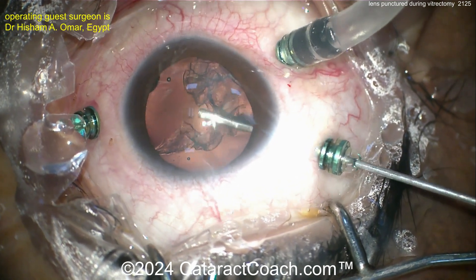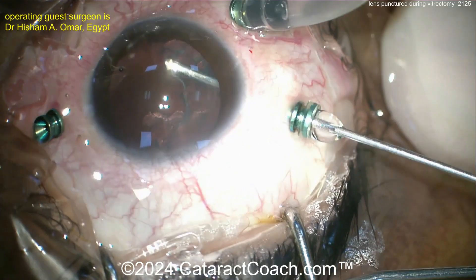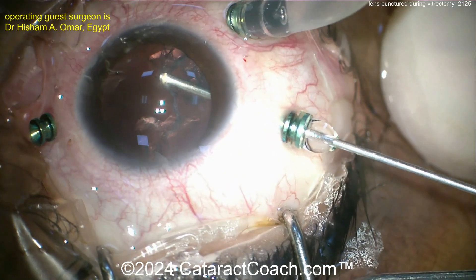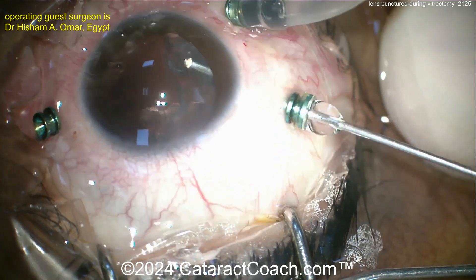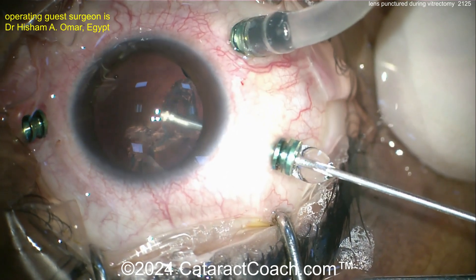Now the question is: what should you do? Can you keep at least the anterior capsule intact, then perform a capsulotomy and place a three-piece lens with haptics in the sulcus and optic capture? That would be a great option. My advice: do not remove the entirety of the lens capsule — leave the anterior lens capsule intact.